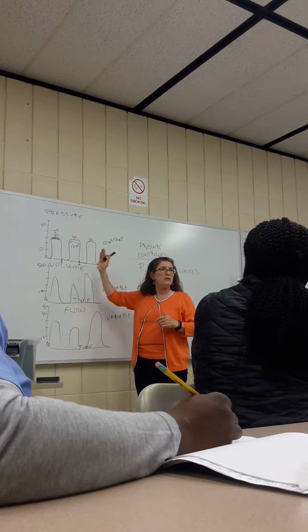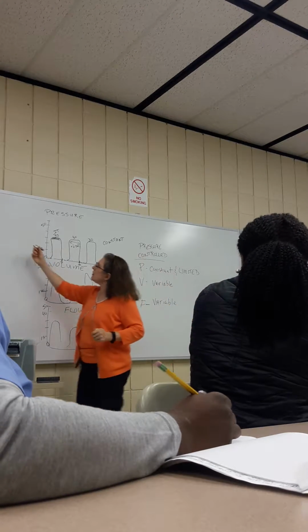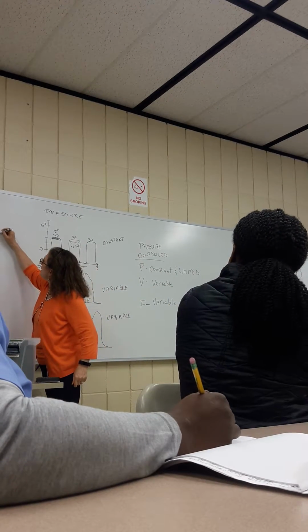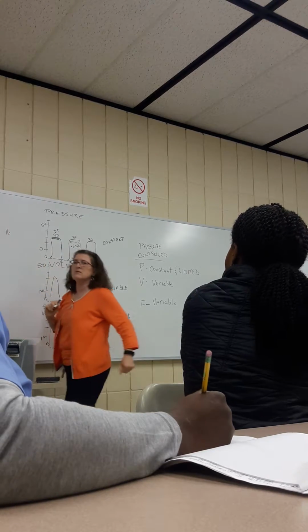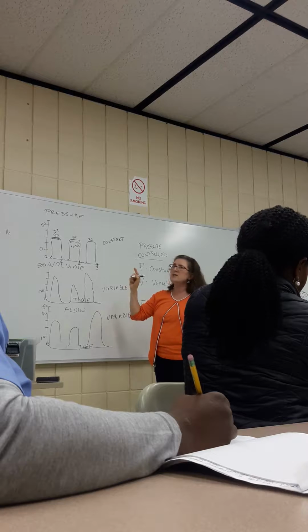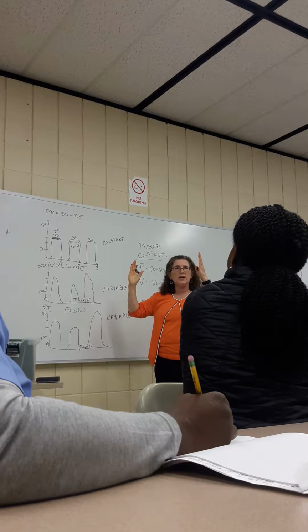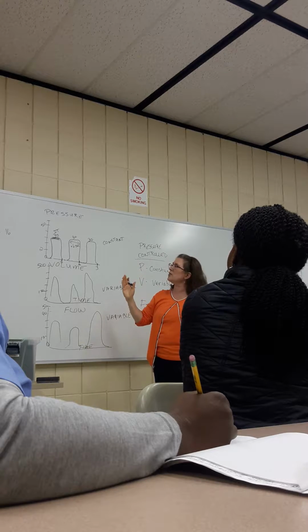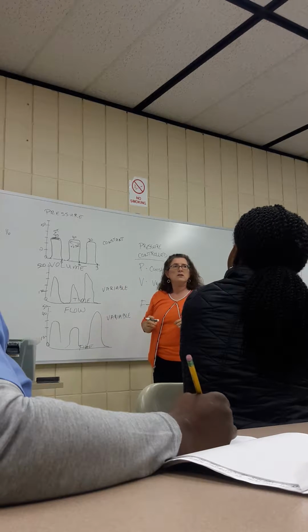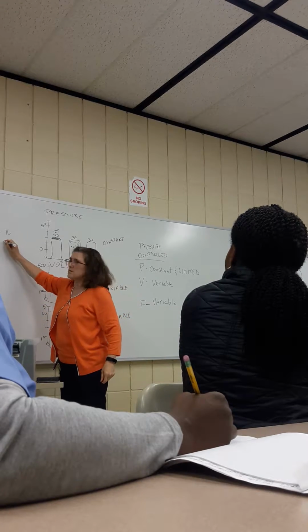give it a breath. So let's say I have a respiratory rate dialed in of 16. How many seconds is each total cycle time from one breath to the next? How am I going to determine that? 60 divided by 16.